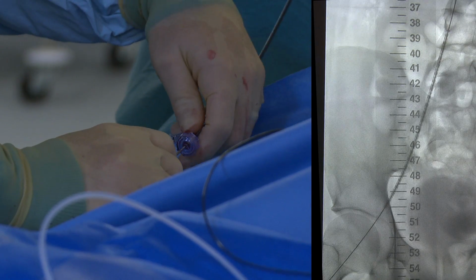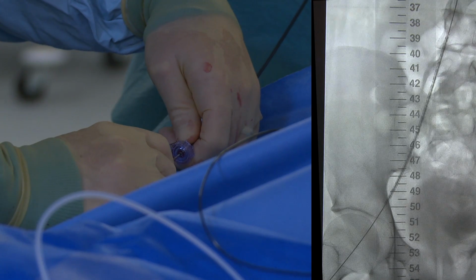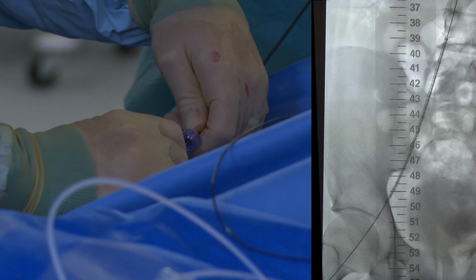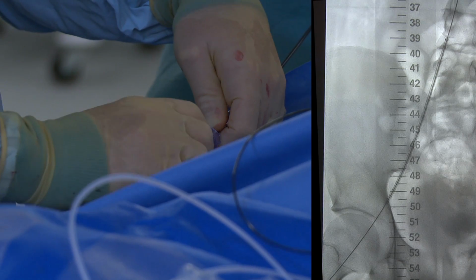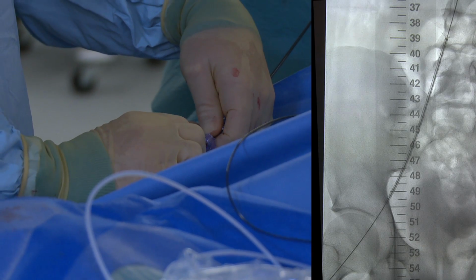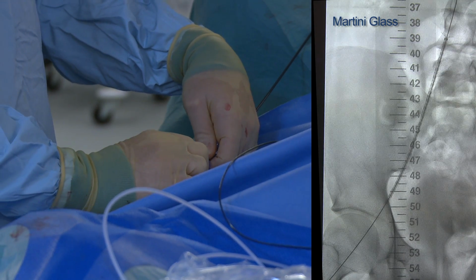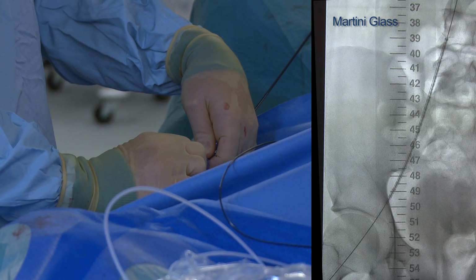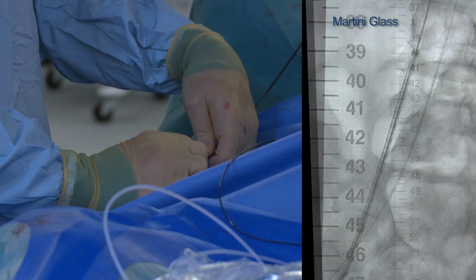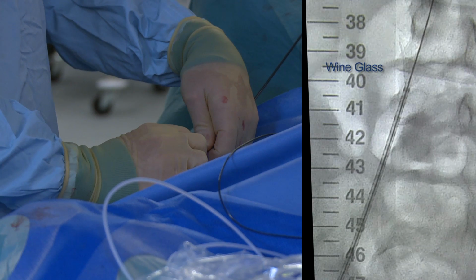the inner shaft hub. As deployment begins, some resistance will be felt. With the inner shaft hub secured, continue to deploy. The resistance will be reduced as deployment continues. As the stent opens, a martini glass shape is observed. At this point, the stent can be repositioned. As deployment continues, a wine glass shape is observed, and you are committed to this position.